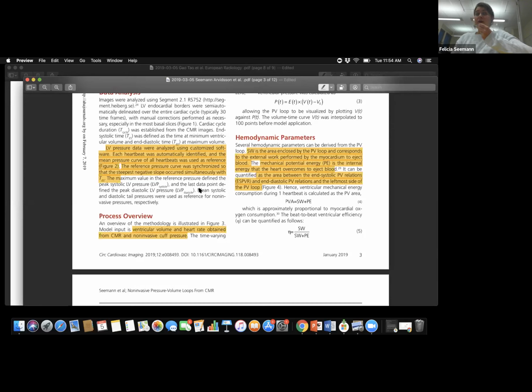The other big limitation is, of course, that we did not do any non-invasive estimation of the end diastolic pressure. So this is an input from the user, who has to estimate this themselves and provide it to the model. But I think maybe this previous paper that we presented could help us in that quest for getting a non-invasive estimation.